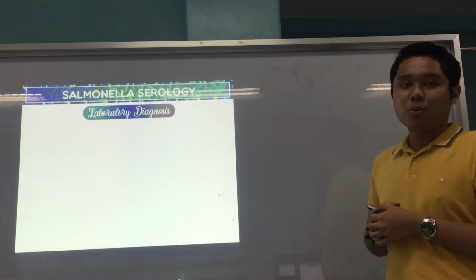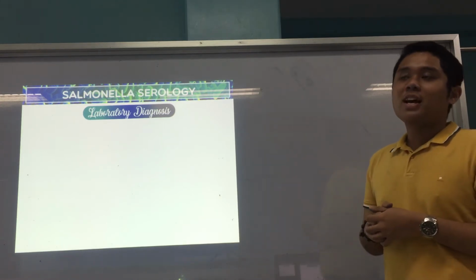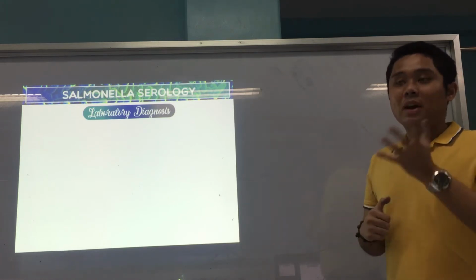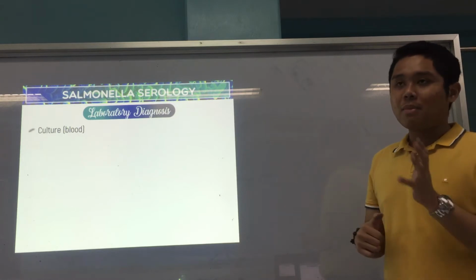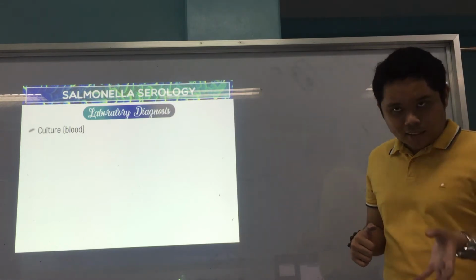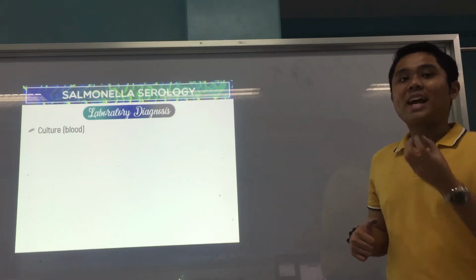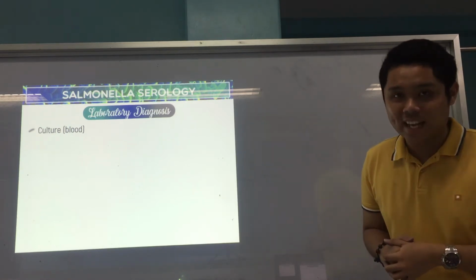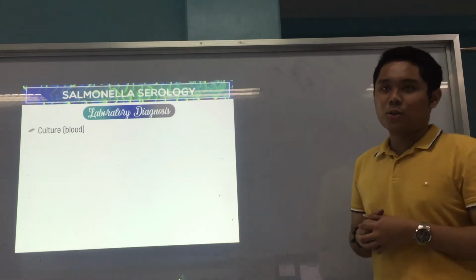And welcome now to the second video, the continuation of our lecture on Salmonella serology. For this lecture, we're now going to focus on the different laboratory methods to diagnose Salmonella infection, especially typhoid fever. Of course, the gold standard for any bacterial diagnosis or identification, except bacteria that produce toxins, is culture, always culture.